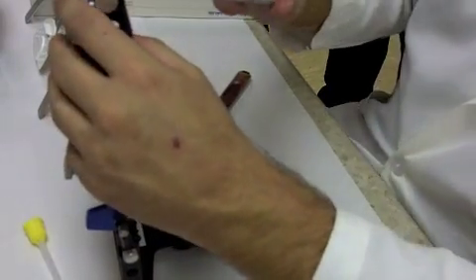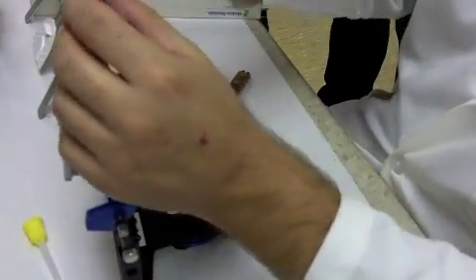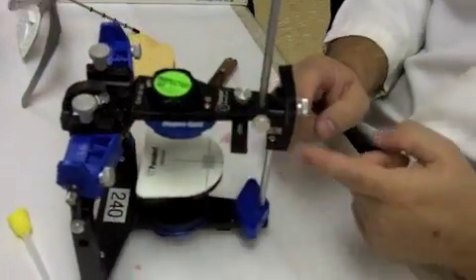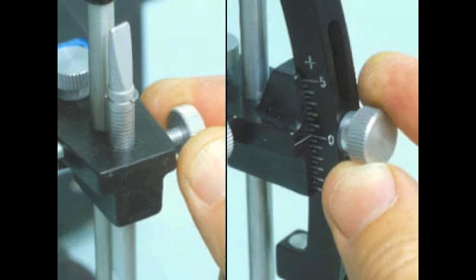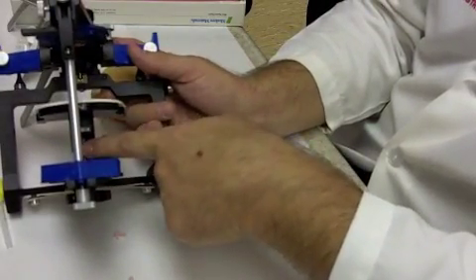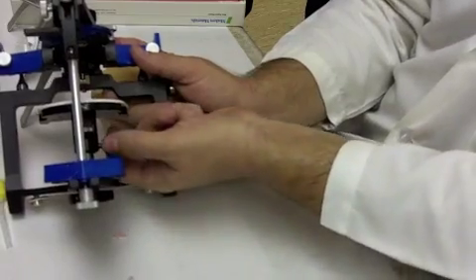For a simulated patient, we can do things a little bit differently because of the fact that we have a patient with no head. Some of the references that we would use are all parallel with the horizon, so we can use something a little different. The first thing you want to make sure is your pin is set at 0. Now on your articulators you do have 2 pins, and so make sure that second pin is out of the way. Then you want to put the facebow table with that white plate on it.